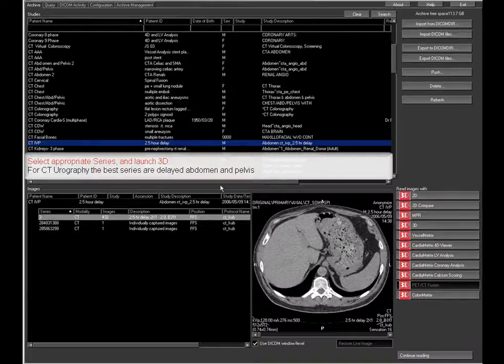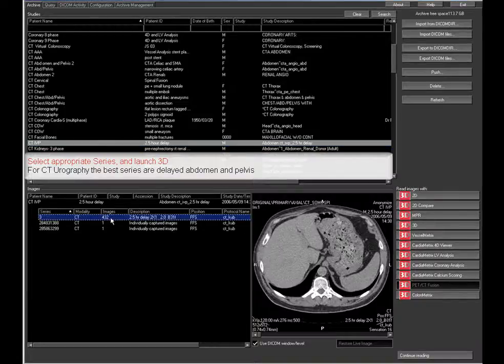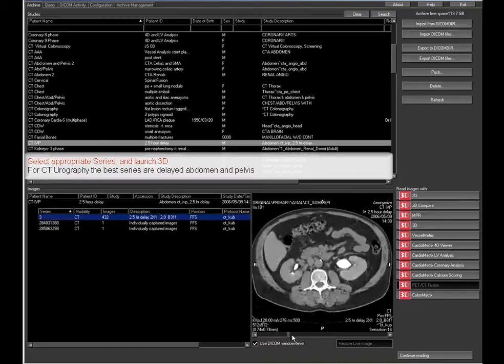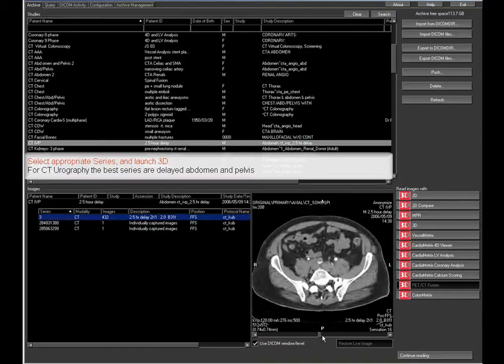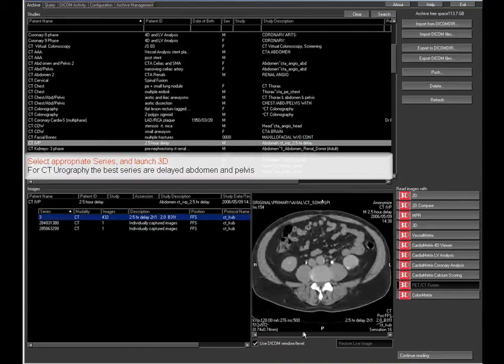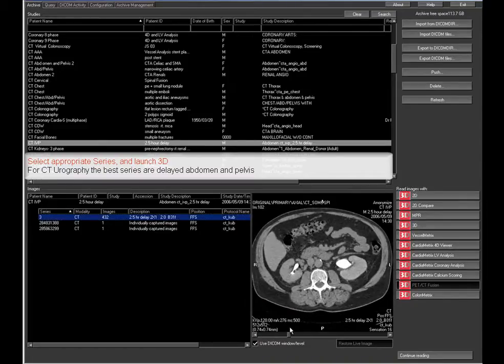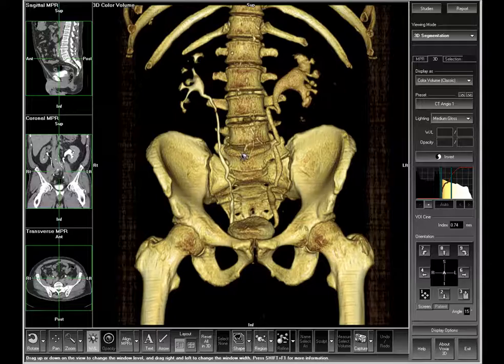The best series for the CT urogram are delayed abdomen and pelvis series, where the kidneys, ureters, and bladder are filled with contrast material. Select the appropriate series and read images with 3D.